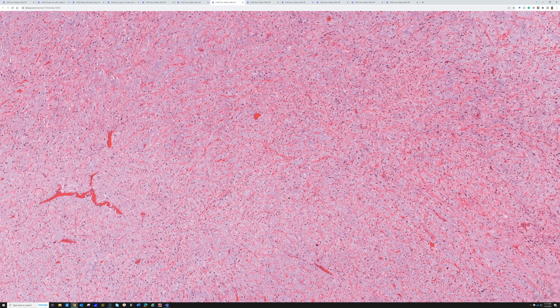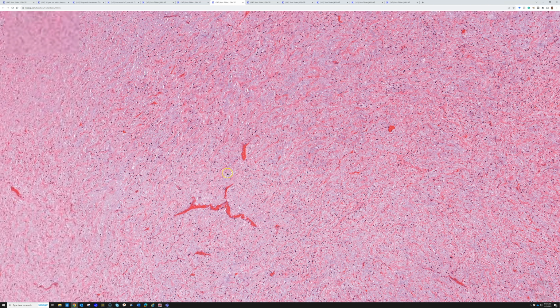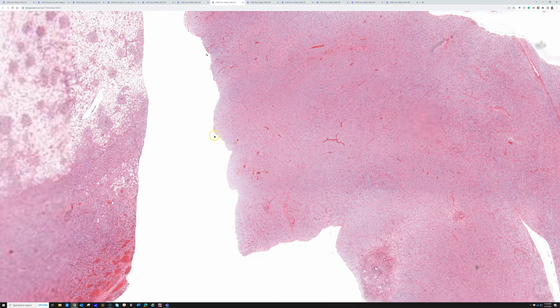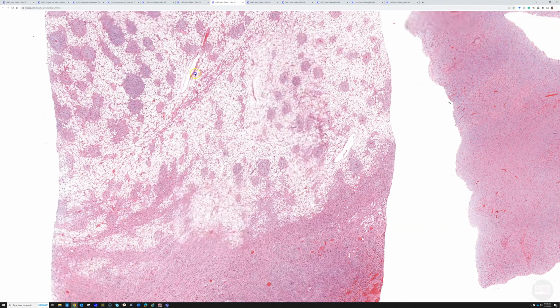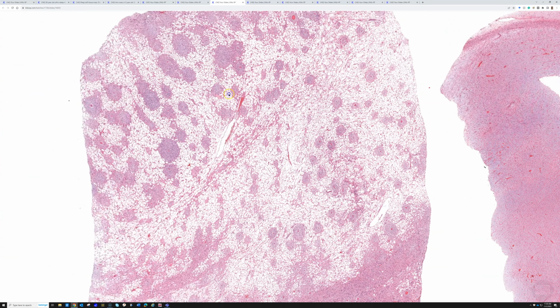If I think I see myxoid liposarcoma in the retroperitoneum, it's almost always going to end up actually being a dedifferentiated liposarcoma, or maybe a well-differentiated one with myxoid change, depending on the cellularity and mitotic activity. Or, I've not encountered this in real life, but there are cases of this, a person that has myxoid liposarcoma, say, in their thigh, and then they get a metastasis to the retroperitoneum, because true myxoid liposarcomas can metastasize to weird, unusual locations. So this is just another area. Again, this is the same tumor as the last two slides, just a different area.